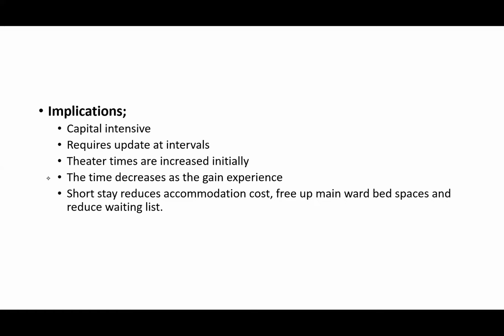Now, especially the energy devices that we use. Some of these energy devices are advanced and they enhance surgery, the speed of surgery, and better outcome. If you compare a surgeon just using a diathermy, maybe an L hook, and a surgeon that is using a ligasure or harmonic scalpel, of course, these harmonic scalpels are more advanced tools for dissection. So you expect faster and better outcome.